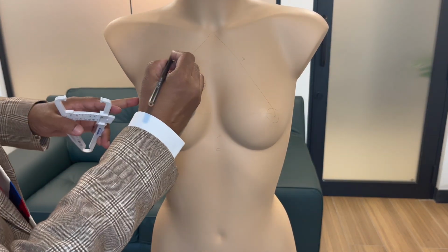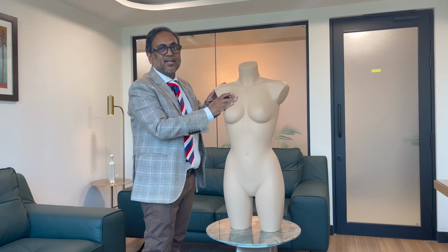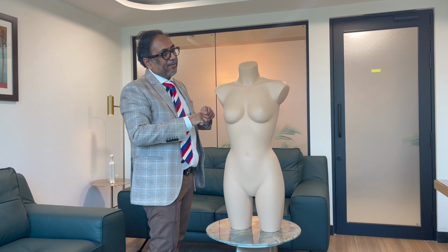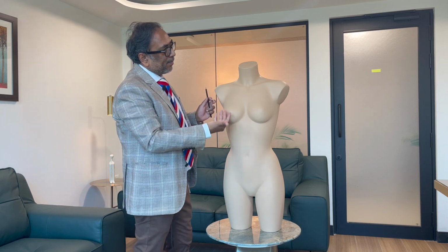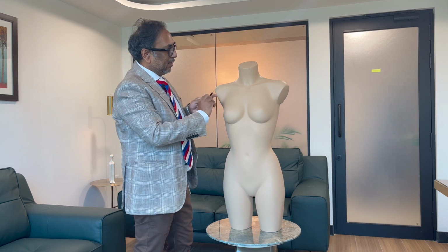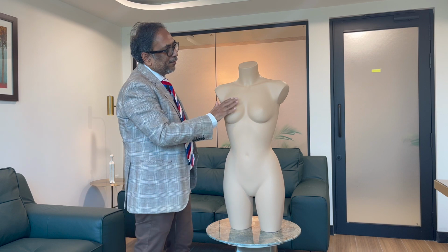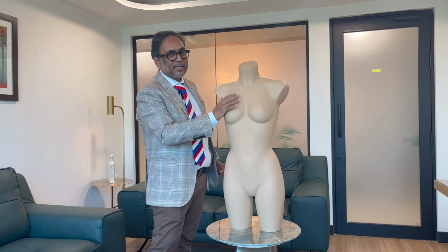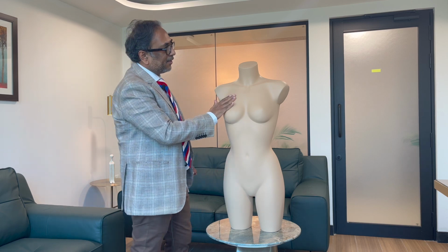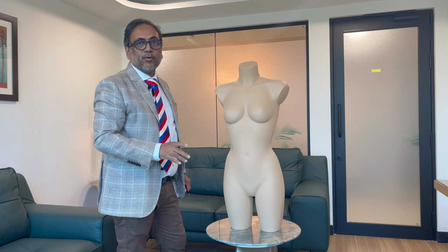If this distance is, let's say, less than 2 centimeters, which means the implant is not going to be covered adequately by the tissue, and thereby we choose to place the implant under the muscle. But if the distance is more than 2 centimeters, there's going to be an adequate cover for the implant, and we can place the breast implant just behind the breast tissue. So that's another important measurement that we're going to take.